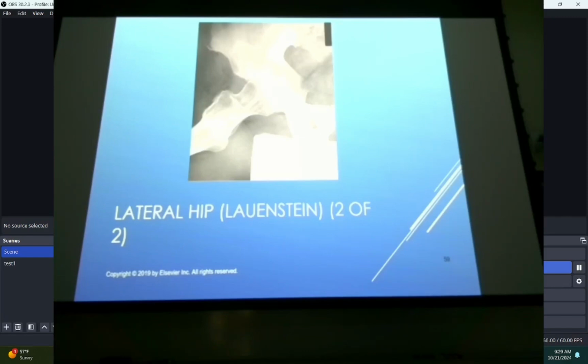And what that does is that when you make an exposure, if you hit plus, it just gives you more mAs. I'll explain it a little bit deeper in physics, but if you hit +1, it gives you a little bit more mAs. If you hit +2, it gives you a little bit more than +1, and so on. If you hit -1, it goes in the opposite direction. So if you can't position directly over the photocell, you hit it with +1, +2, +3, something like that. It kind of compensates for your positioning error.